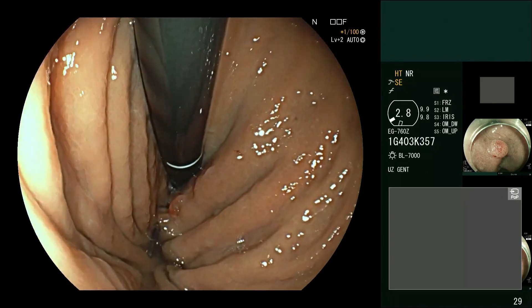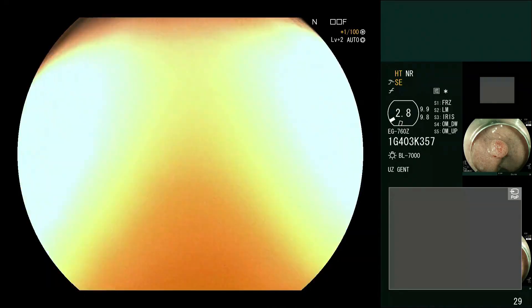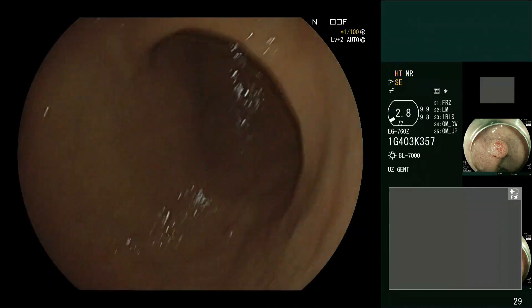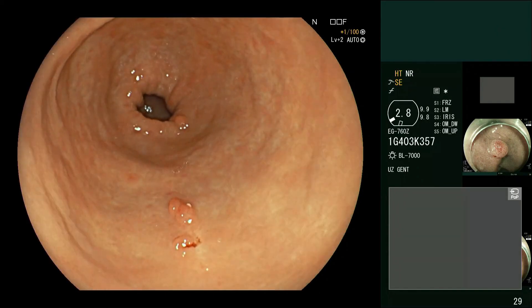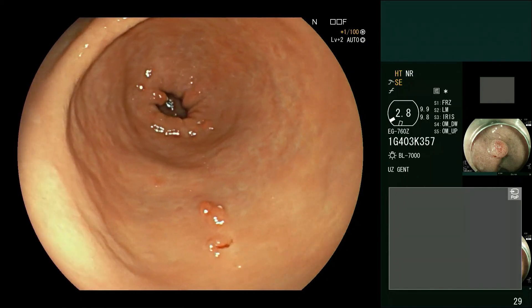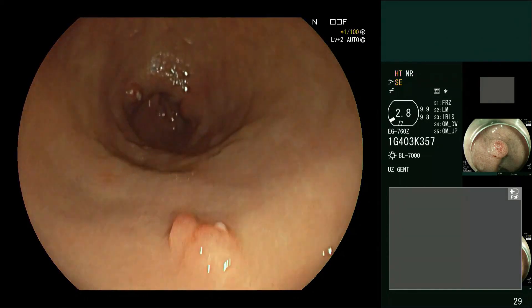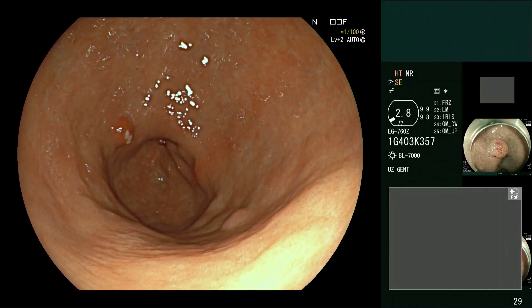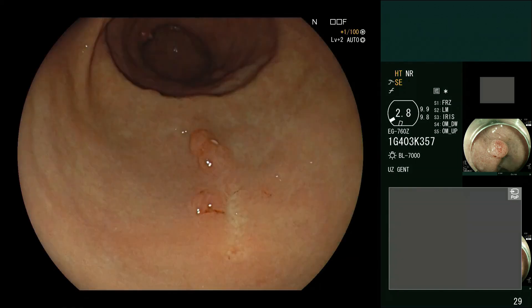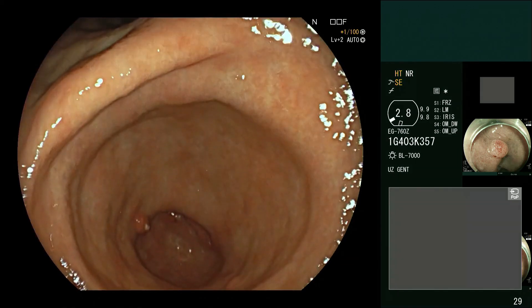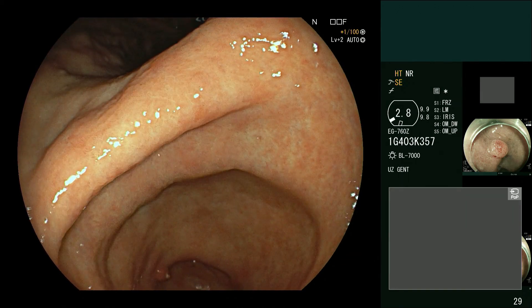What I'm doing here is not a particularly adequate examination of the stomach. You need to really look at each segment. You probably need to wait for peristalsis — you can see now a whole new bit of the antrum has opened up. You need to freeze the image, have a good look, pause and think. Then you need to think about the other areas. You need to look at the angulars, pause and think, and take some photographs.